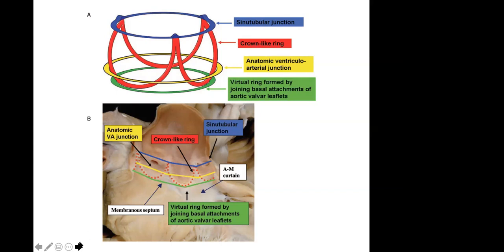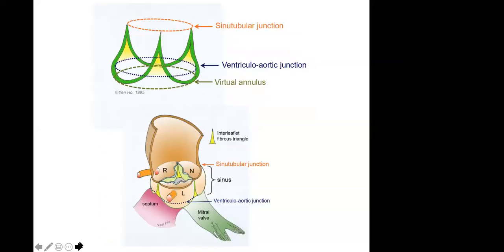There are some important structures, either in surgery or in transcatheter, especially with the sutureless aortic valve and TAVI as well. Namely the nadir, especially the nadir, and how to locate the nadir, especially now as Perceval valve is going more and more, especially with minimally invasive, I believe.